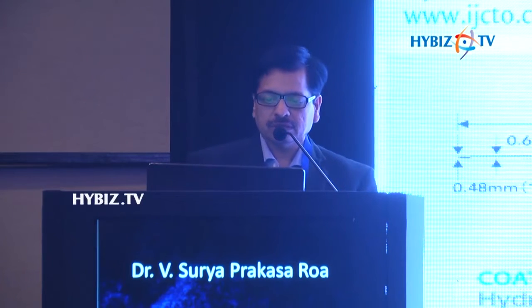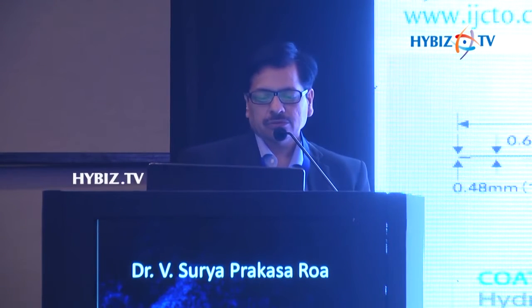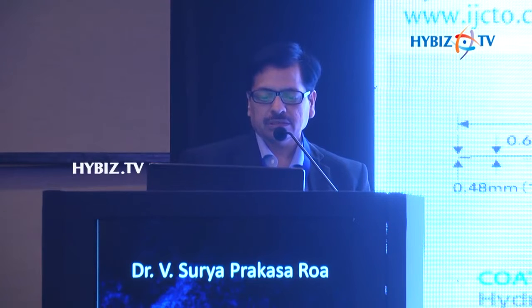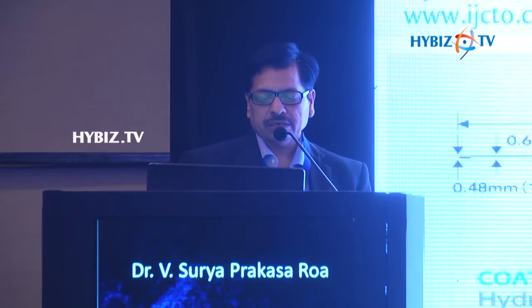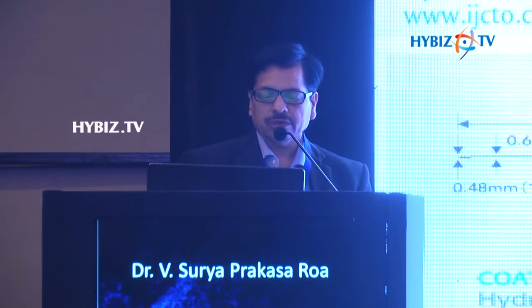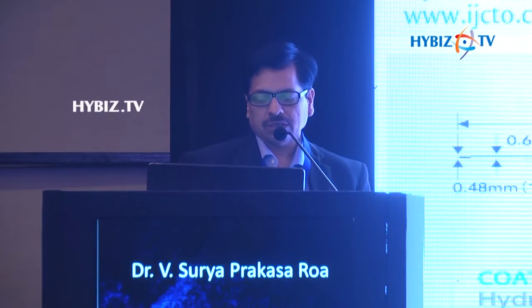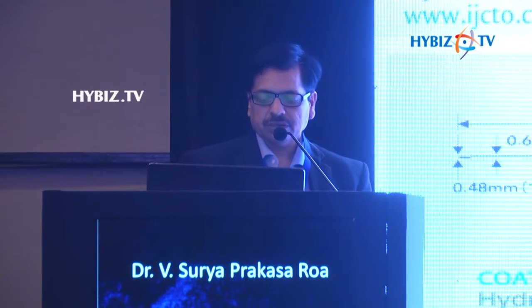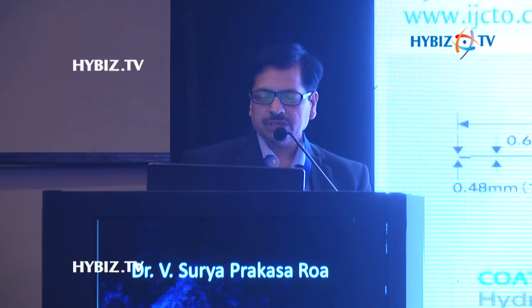So this is one, already my colleague Dr. Kopati described this Carvel catheter, which is still not available in India. The main advantage is that the tip profile is less than the Corsair, and it is more hydrophilic with better trackability through collaterals. Sometimes you're not able to cross with the Corsair, and Carvel makes a big difference. The distal tip profile is 1.9 French. That's the advantage of the Carvel.